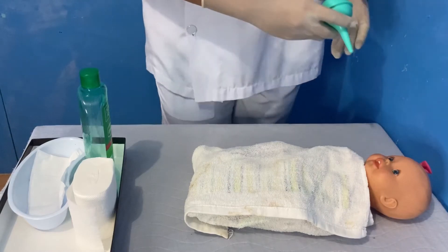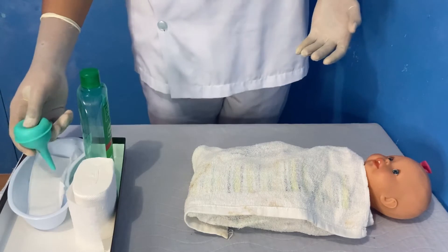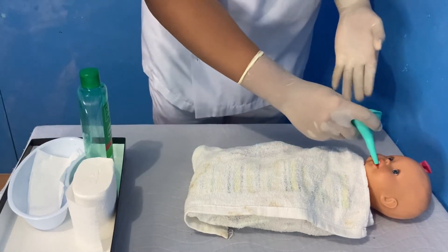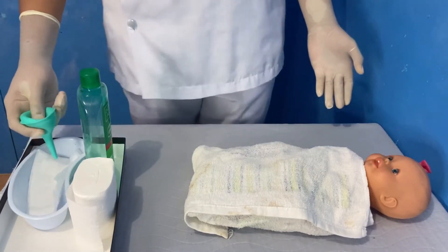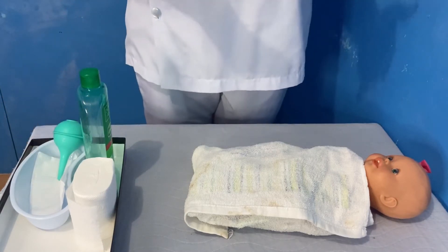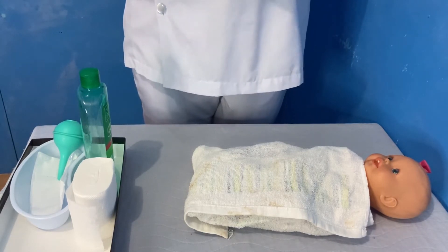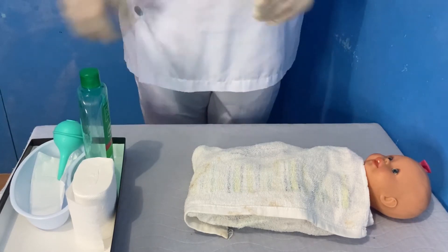Remove the bulb syringe from the newborn's mouth and gently squeeze the bulb syringe to release the collected secretion into an appropriate receptacle or tissue. As soon as the infant's body is born, hold the infant with the head slightly dependent and keep the infant warm by drying and providing radiant heat. Repeat each step to suction the other side of the newborn's mouth, and if necessary, repeat to suction each nare.